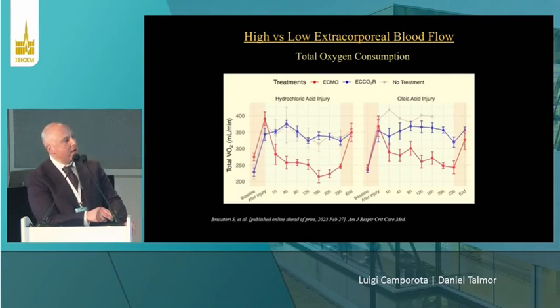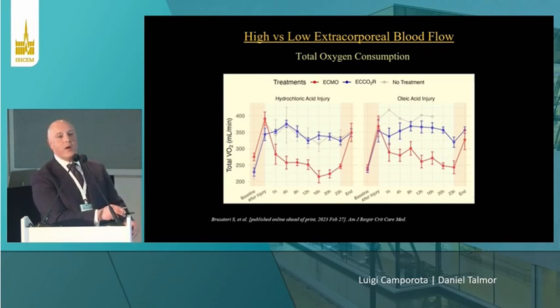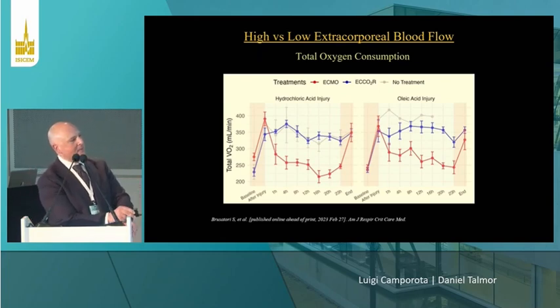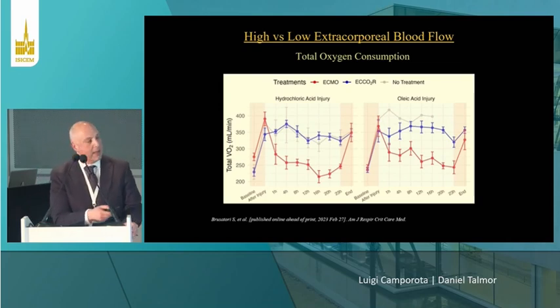But this is just, if you can follow here one second, you can see this is the time axis on the horizontal side. And what you can see is the total VO2 on the y-axis. And you can see ECMO is in red, and extracorporeal CO2 removal is in blue. Now, first of all, once the animals were randomized and then the gas flow was started, either into ECCO2R or ECMO, you can see that animals on ECMO had a much quicker reduction in VO2. So they start utilizing less oxygen. They start essentially requiring even less oxygen. Whereas you can see in both models that using extracorporeal CO2 removal, the VO2 goes up. So there is a lot more energy and oxygen requirement in this subgroup.